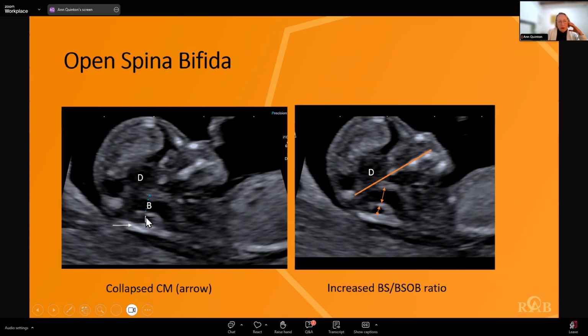And again, we've only got the one eye here, and we've got no cisterna magna, okay? And then that brainstem looks larger. We can see it measured over here than the BSOB area, so just in here. We can actually see a bit of choroid sitting here though. And then that line running on the maxilla, and you can see that the diencephalon or the thalami has been pulled down towards the posterior fossa in this brain, and there's that sort of junction area sitting on the line again.